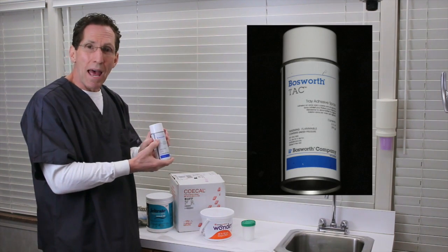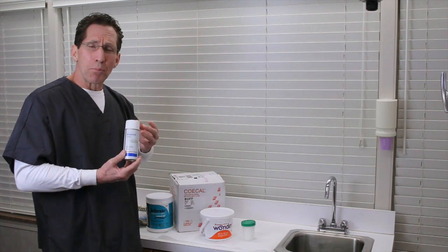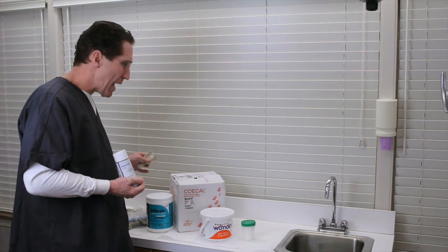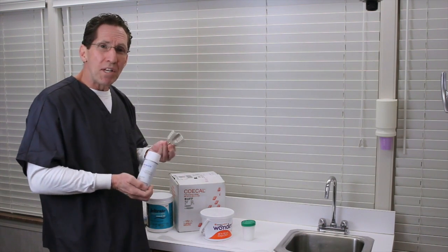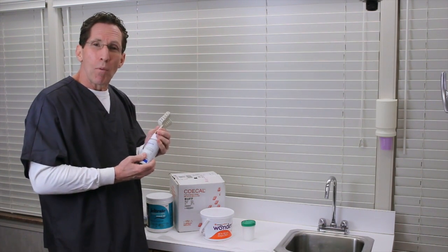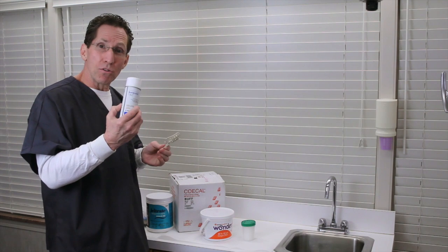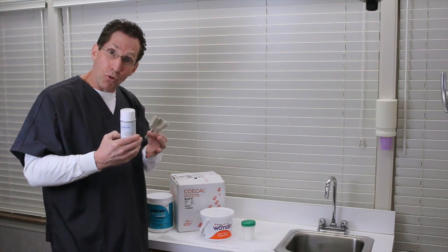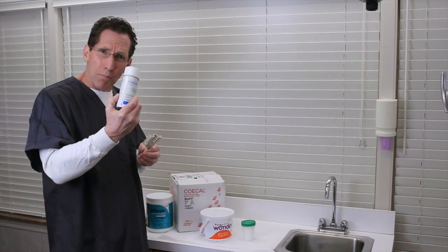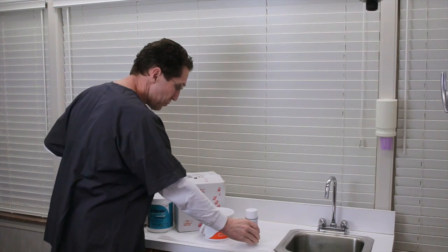Next, we have our material, our tray adhesive. This is Bosworth tack. You can also use hold, but some type of a tray adhesive. We need to understand and appreciate that even with the perforated trays we have here, we can't rely on these perforations to retain the impressions. When we take the impressions the way we're going to be showing, when we inject into the vestibules and we get a really good suction of those trays, when we're trying to withdraw them, oftentimes if we don't use the hold or some type of a tray adhesive, we'll find there's actually a separation and then distortion of the impression. So I highly recommend and will demonstrate the use of this. Again, this is tack, but you can also use hold.